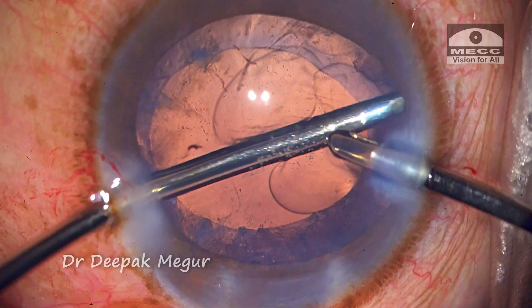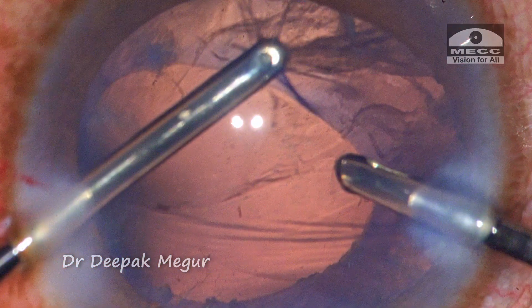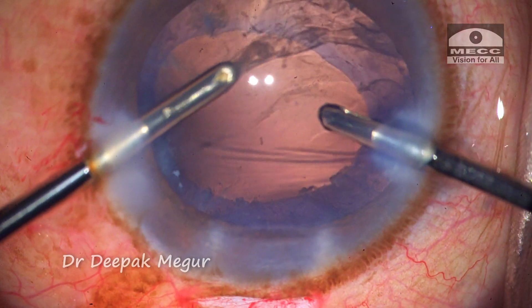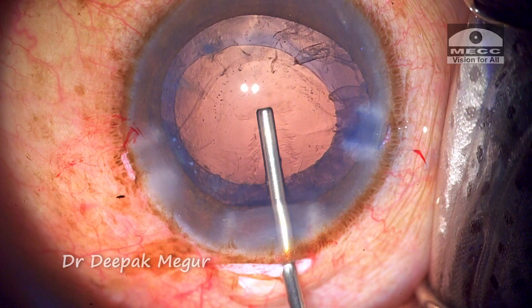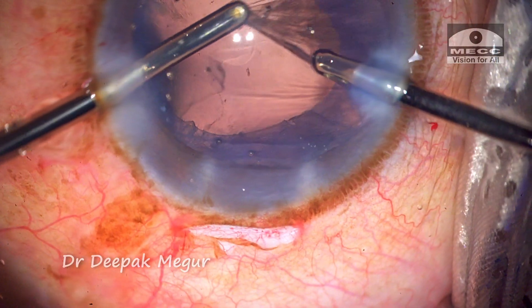There is a moment where the aspiration port accidentally catches the anterior capsule and we can see the bag getting distorted. However, it is immediately released. OVD is re-injected to deepen the bag and then all the remaining cortex is removed successfully.